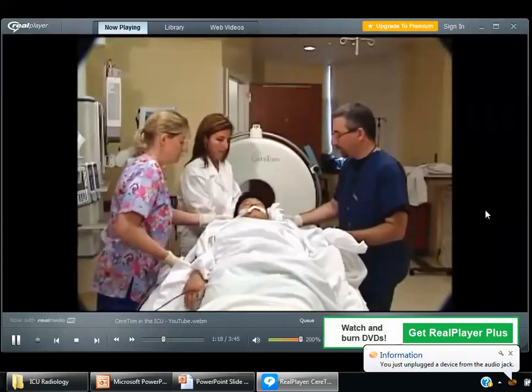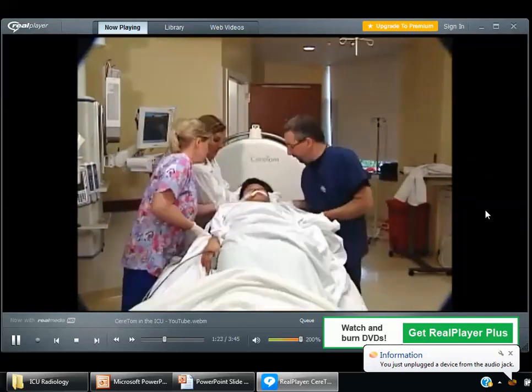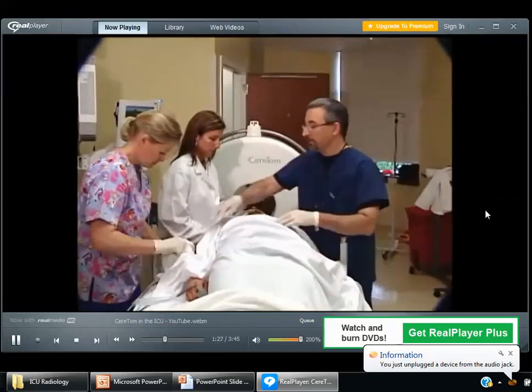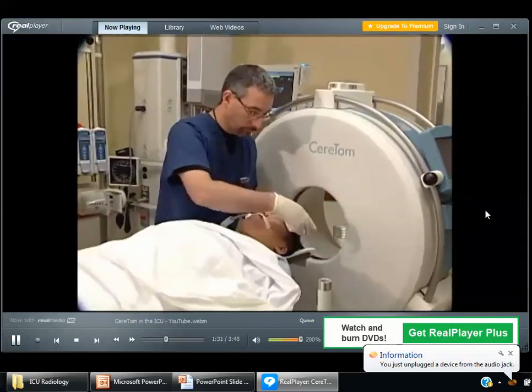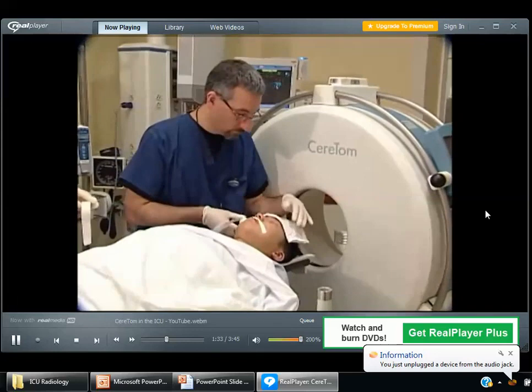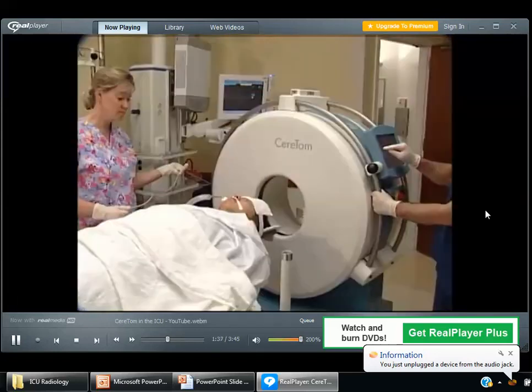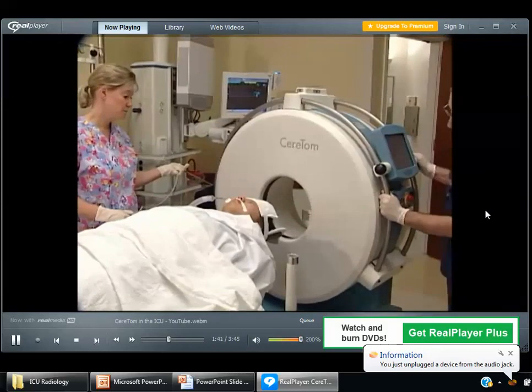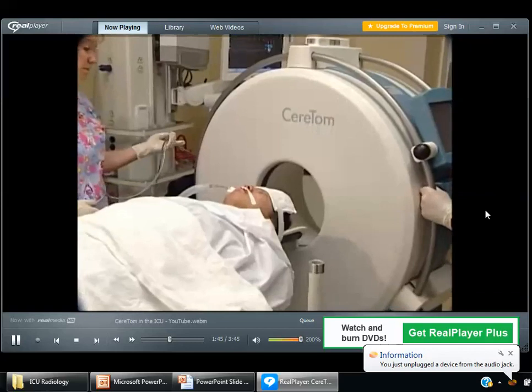With at least one person on each side, slide the patient onto the scan board. Larger patients or vented patients may require an additional assistant to help guide the patient's head during the move. Immobilize the patient's head with a head strap. Securing the patient's head is one of the most important steps during the patient setup. Once the patient is secure, lower the scanner onto the centipedes, making sure that the scanner is as perpendicular to the patient as possible.